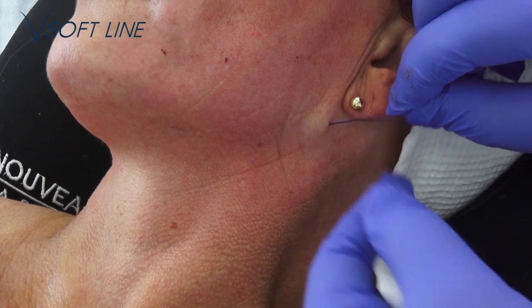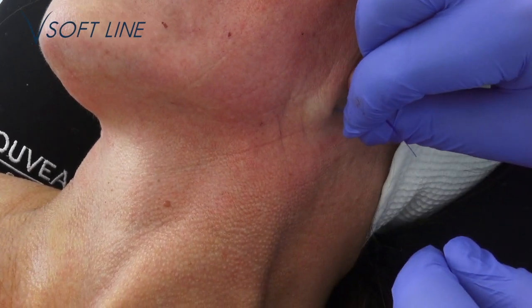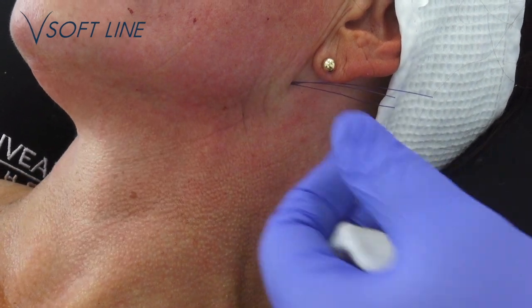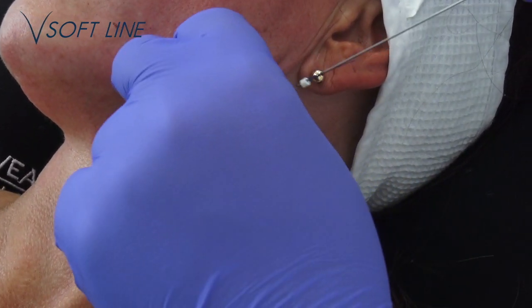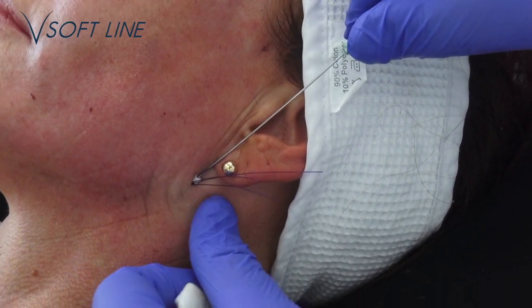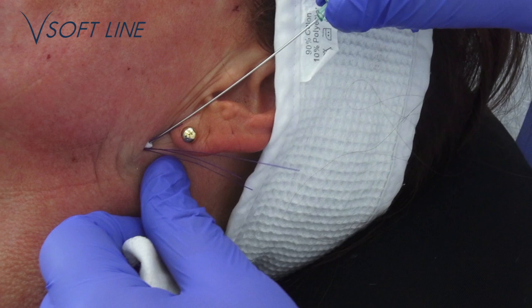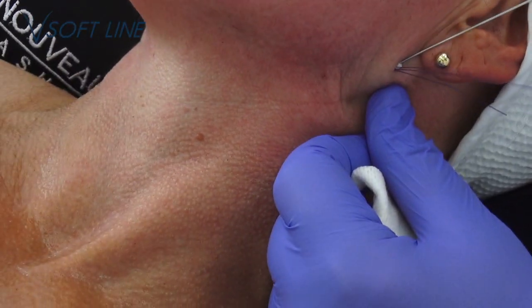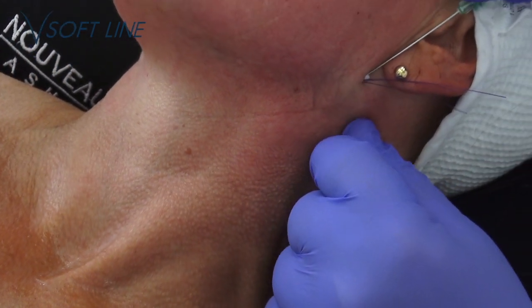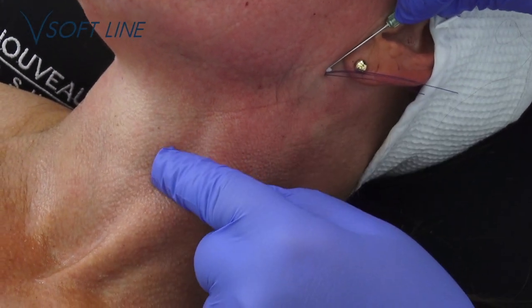Now we have all the 3 threads here, and the last one. This is the last barb thread for today. And the most fun. It is placed in parallel with the sternocleidomastoid muscle, this one, along the front edge there. Consequently, we achieve a line.